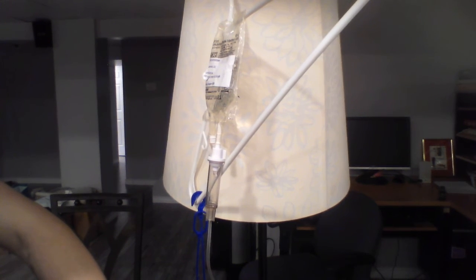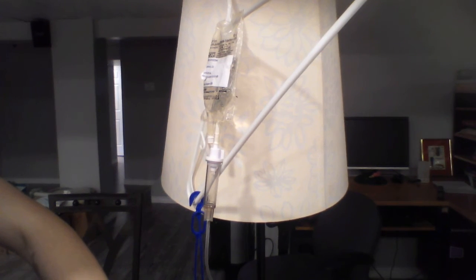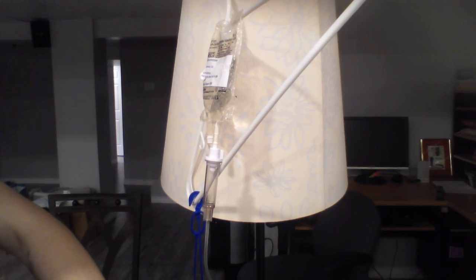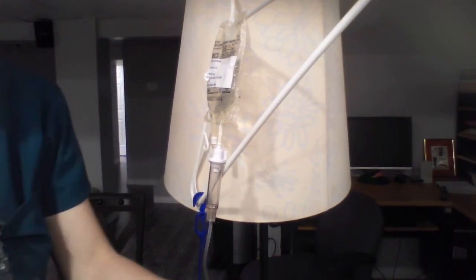Now. Okay, perfect. It's running at 25 drops per minute.